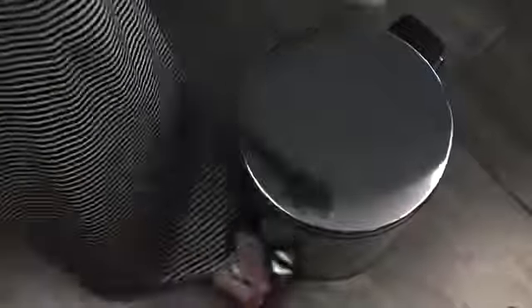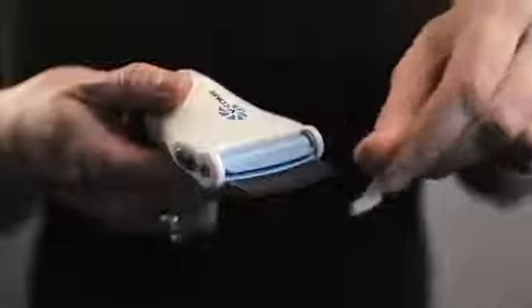After treatment is complete, immediately remove the capture filter from the V-Comb and replace the lid before discarding. With the brush provided, clean any head lice and eggs that might be caught between the teeth of the comb.